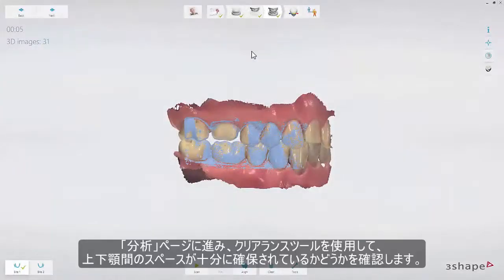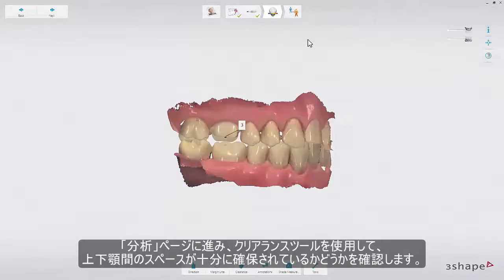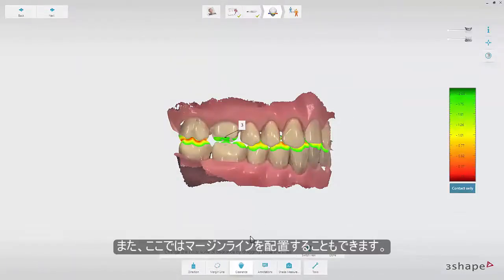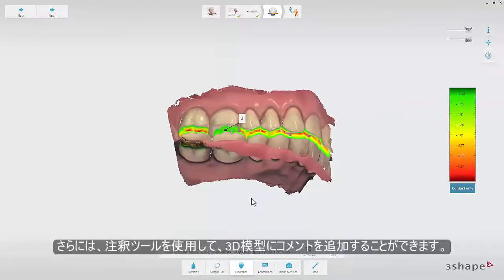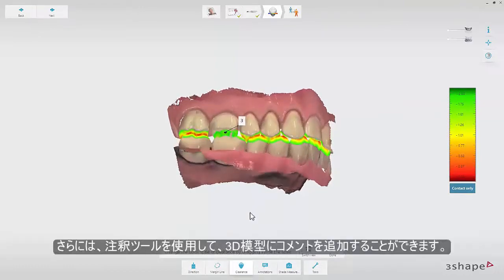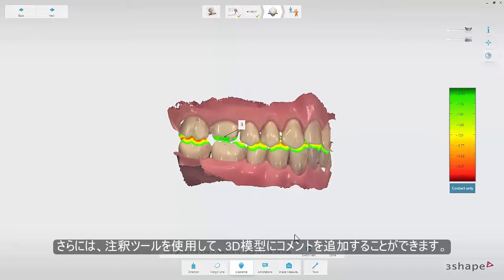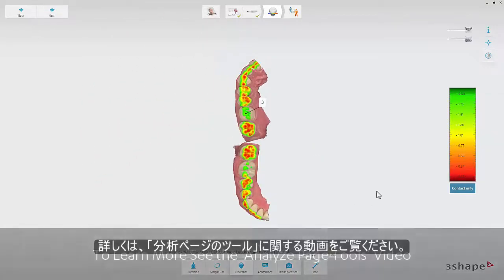Go to the validation page and confirm that there is enough space for the reconstruction between the upper and lower jaw using the clearance tool. Optionally, you can set the margin line. You can also add comments on the 3D scan using the annotation tool. To learn more, see the Trios Analyze Page Tools video.